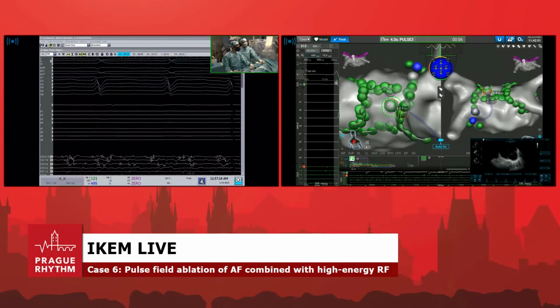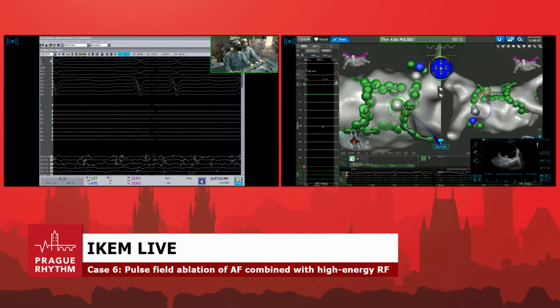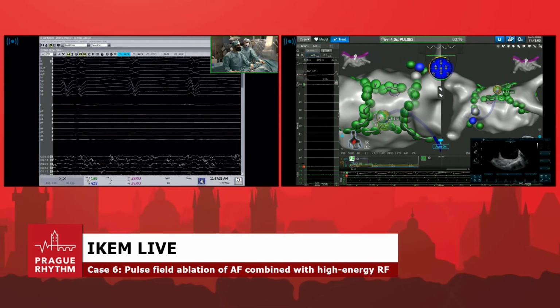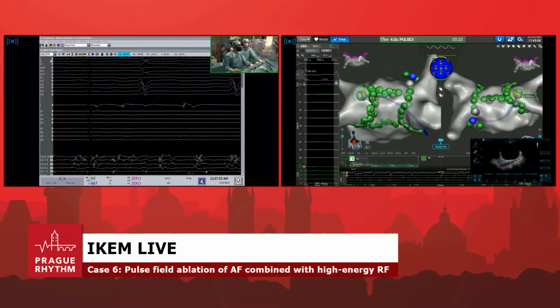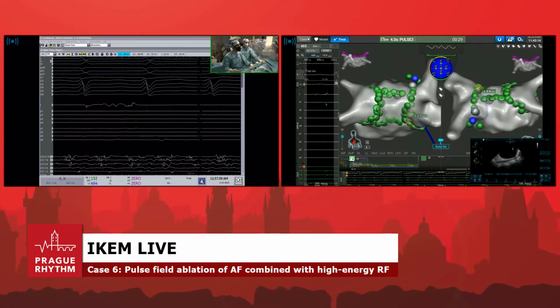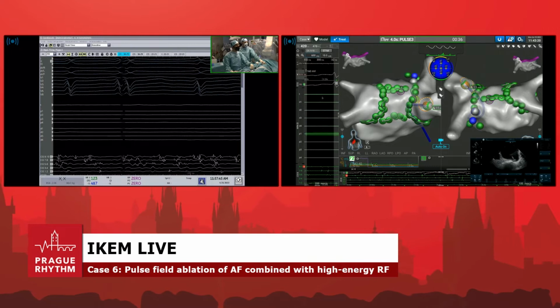On the posterior wall, if you look at the electrograms, there are no electrograms, there's not even a dissociated potential there. The posterior wall is now isolated, as you can appreciate, and there are no electrograms inside the box. When we have sinus rhythm, you can pace from this catheter. Then back in the veins, the left veins look isolated, and the right veins, there are still dissociated potentials there.